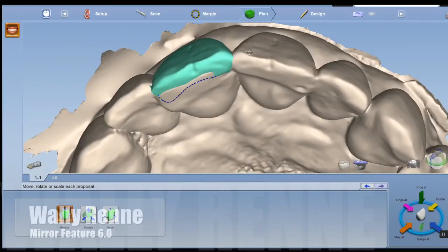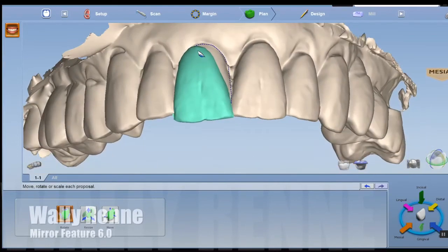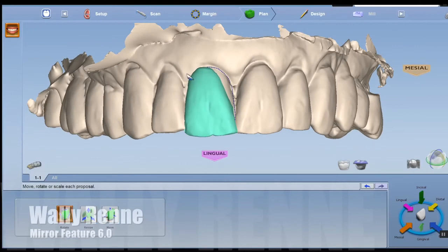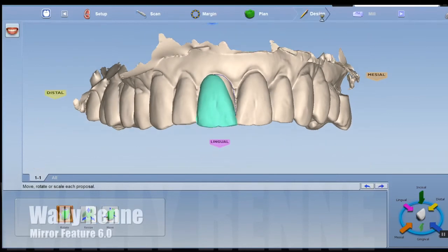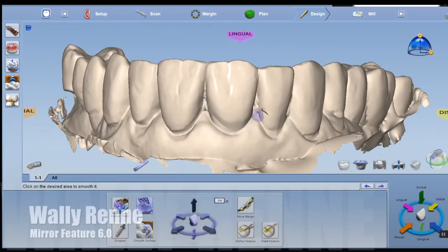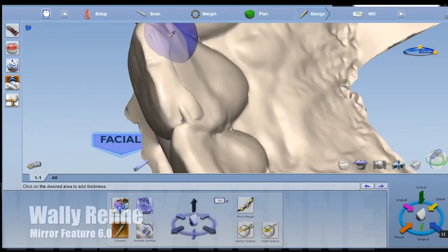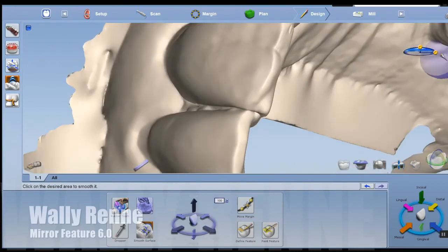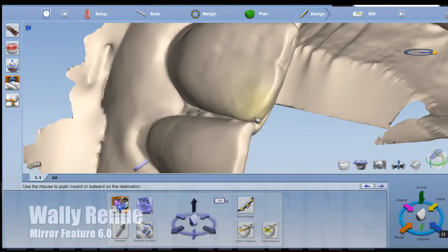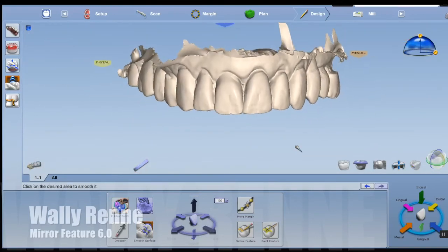You can also mirror designs in the software as well. So if you like a design, you can go ahead and mirror that to the opposite side. In this instance, I'm using a pre-op to mirror. I'm just lining that up, and now I'm going to go ahead and let Autogenesis create an editable restoration there. For speed's sake, I'm speeding up the tweaking I'm going to do to this.